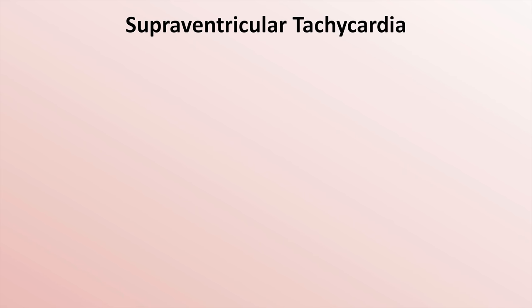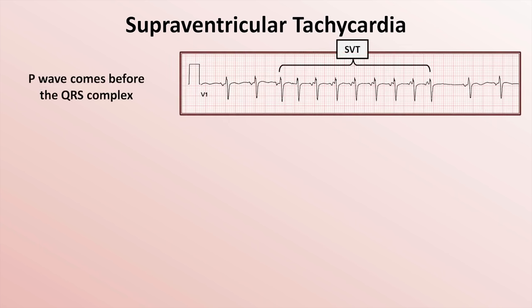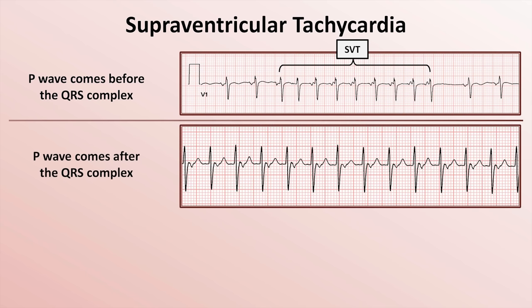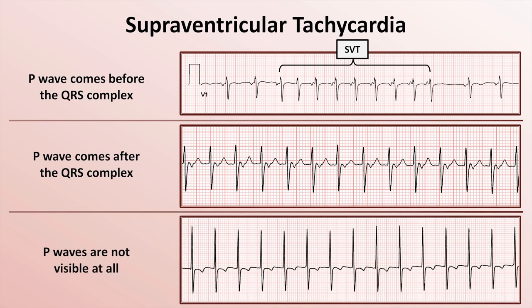Here are three examples of SVT. In the first, there is a short 9-beat run in which the P-wave comes before the QRS, with a morphology differing from normal sinus. In the second example, the P-wave comes after the QRS with an upside-down morphology — if recorded in an inferior lead such as 2, 3, or AVF, these would be called retrograde P-waves, indicating atrial depolarization moving from inferior to superior toward the sinus node. The third example shows P-waves that are not visible at all. The significance of P-wave location during SVT will be discussed in a future video.